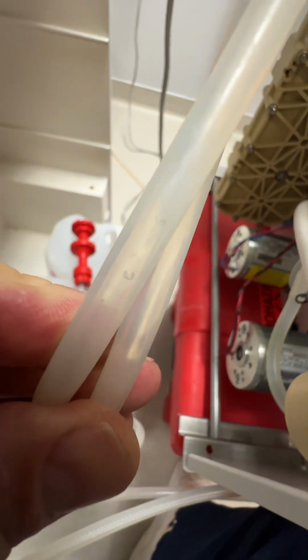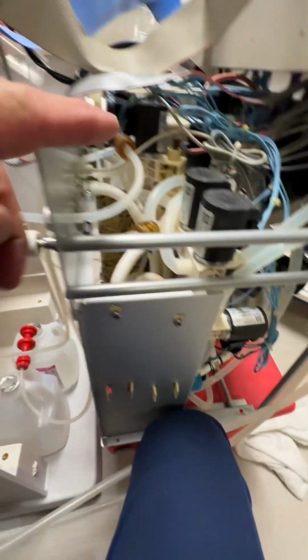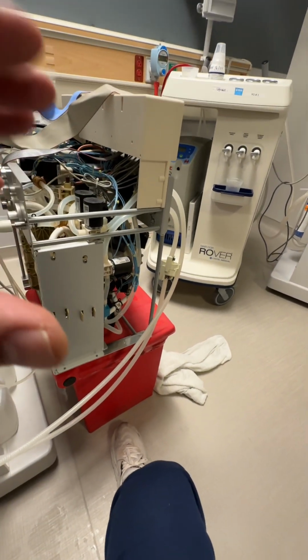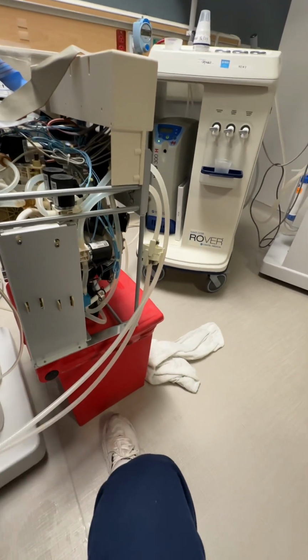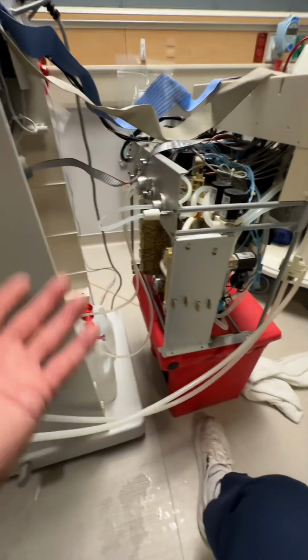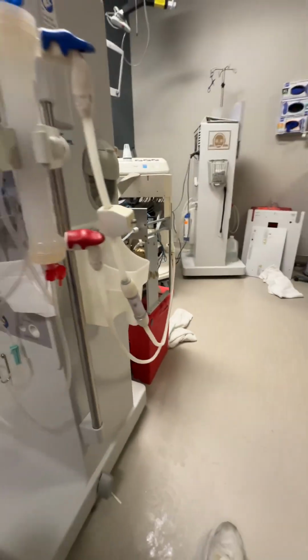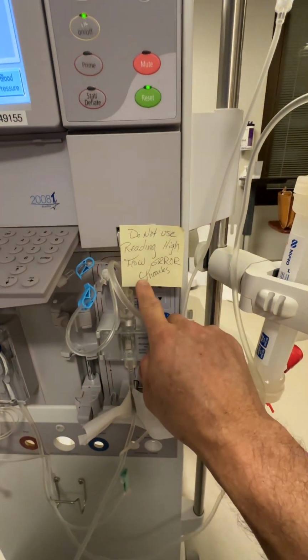But over time, a little bit can become a lot inside the machine. As it gathers air in the machine, little adds up, and then it's a lot of air. And it hits the pump and throws a flow error, because the pump is meant to push fluid, not air. So that's the only thing I can think of with the way the machine's running, is that air is getting into the machine, possibly somehow. But if that's not the case, I need more information.